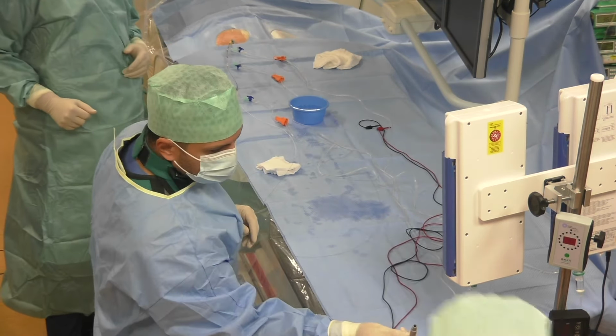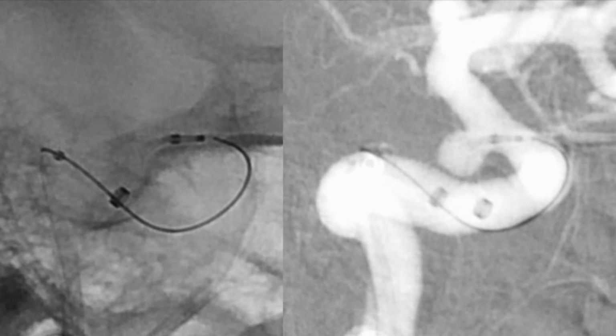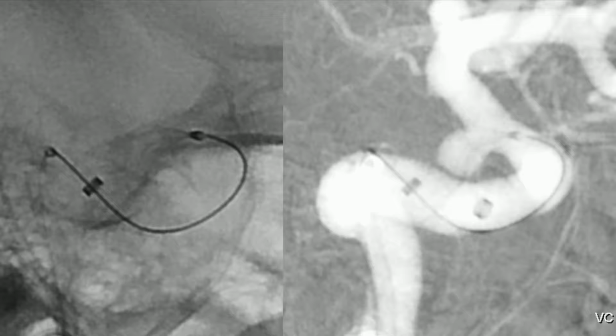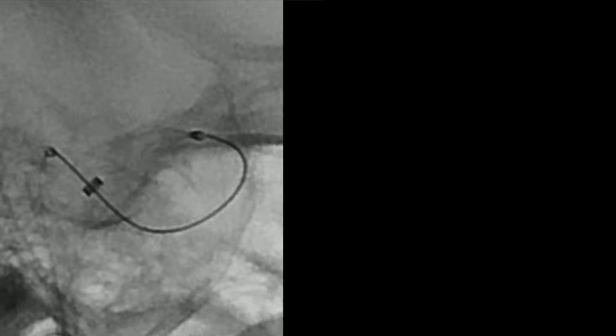And now we are at the neck of the aneurysm. We push the contour device into the aneurysm sac, and at the same time we pull the microcatheter back. But as you can see, the contour device does not open well. That's why we will resheath the contour device and try to implant it a little bit deeper in the aneurysm sac.